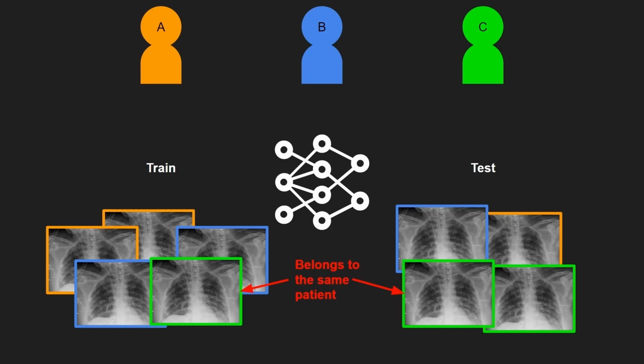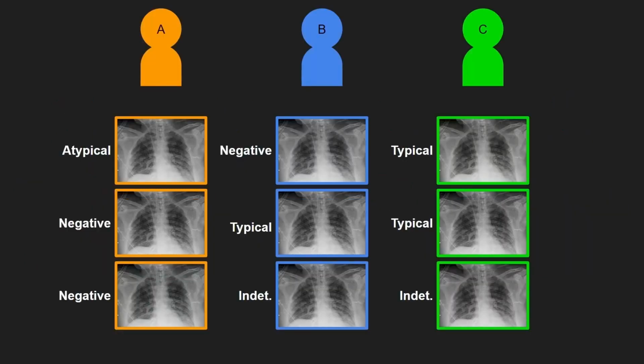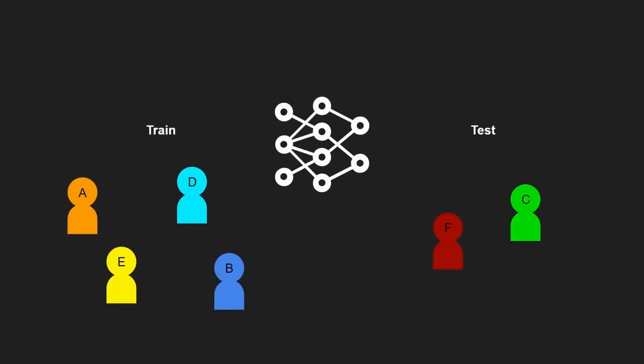The solution starts with how we structure sorting our scans. We'll sort the scans by patient, but then instead of pooling them, we'll label them while they're still grouped with the patient. We repeat this process for every patient. Then, instead of pooling the scans and performing our train and test split, we'll split along a similar ratio of patients. Then, we can safely pool the scans across their categories.